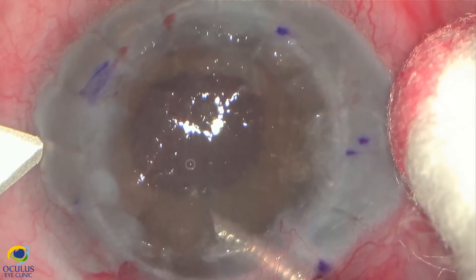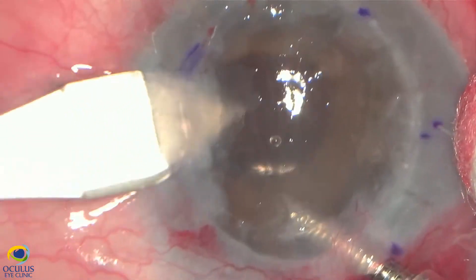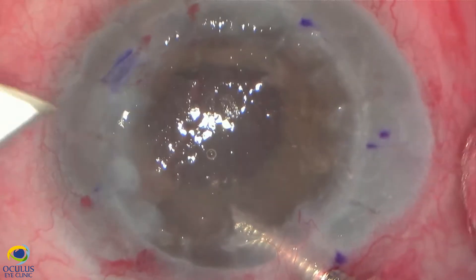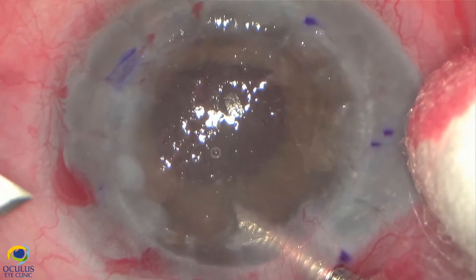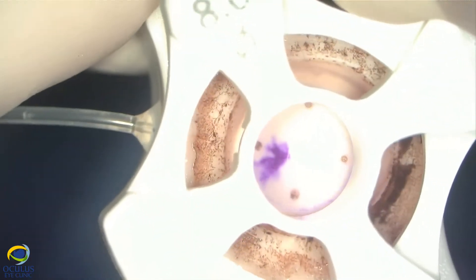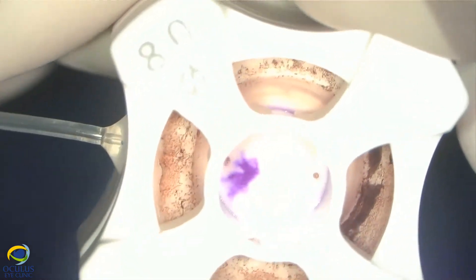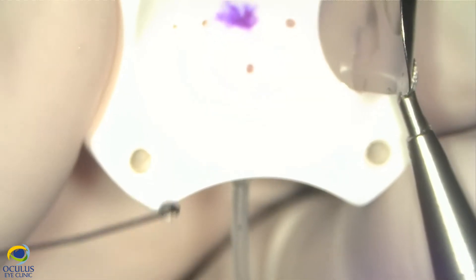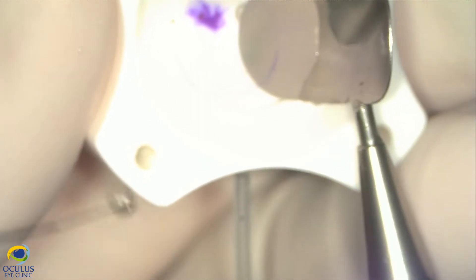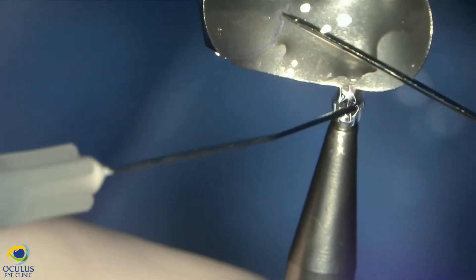Now we enlarge the nasal paracentesis, taking care of that spur of the graft, because we want to avoid its puncture or its detachment from the host cornea. We prepared the DSAEK lamella in the OR using an artificial anterior chamber, marked it with an F letter, and now we place it on a Busin glide very carefully.